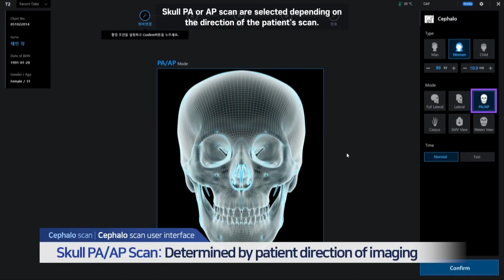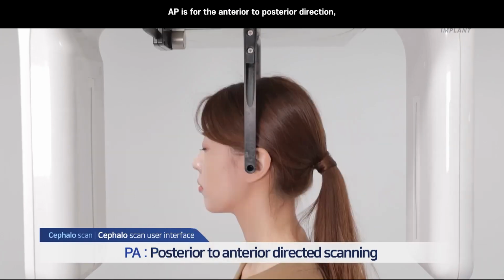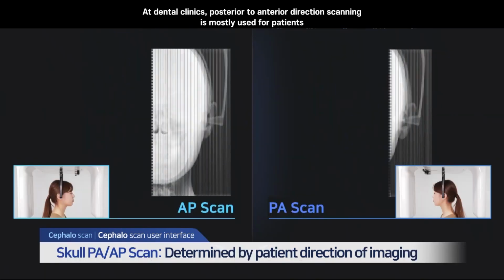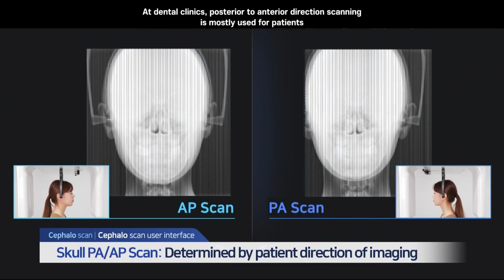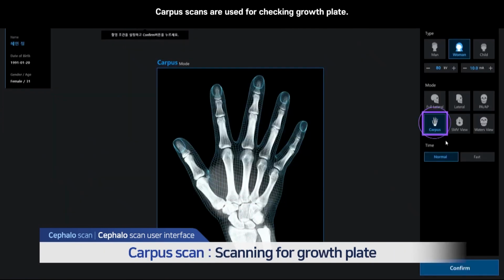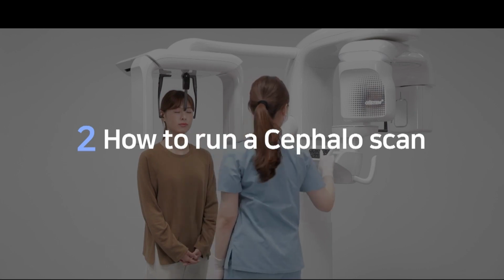Skull PA, or AP scan, are selected depending on the direction of the patient's scan. AP is for the anterior to posterior direction, whereas PA is for the posterior to anterior direction. At dental clinics, posterior to anterior direction scanning is mostly used for patients with an asymmetrical face or for an alignment diagnosis. Carpus scans are used for checking growth plate. The second part is about how to run a cephalo scan.